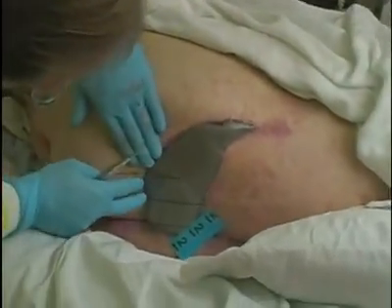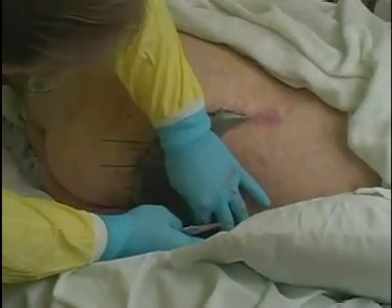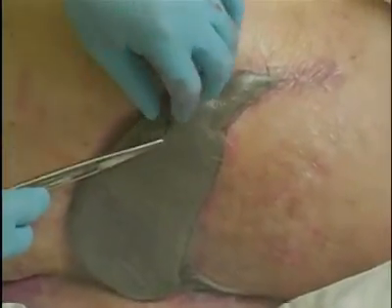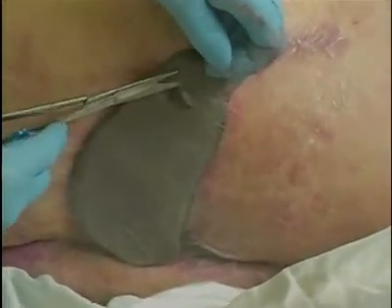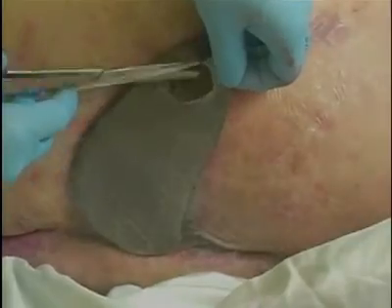Do not discard excess drape. You may need it later to patch difficult areas. Cut a 2 centimeter hole in the drape, large enough to allow exudate to pass through the dressing. Lift the drape with your thumb and forefinger and cut the drape.